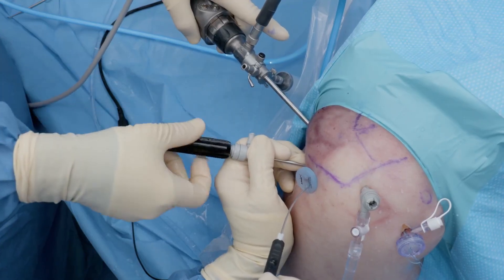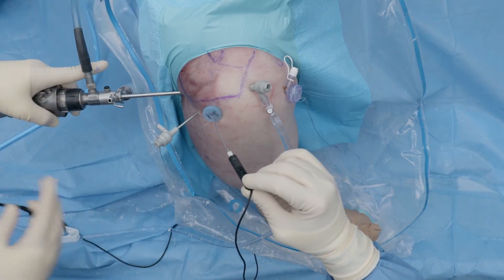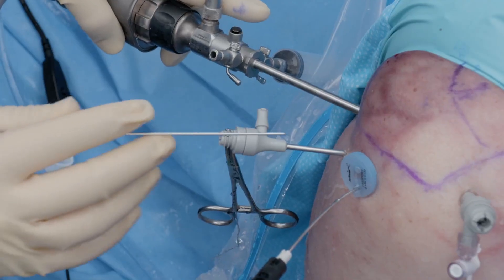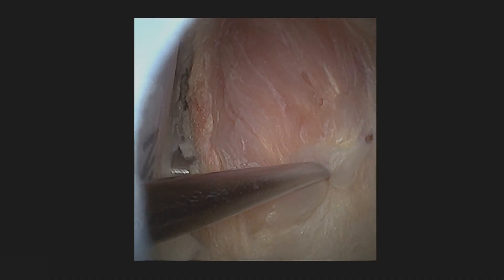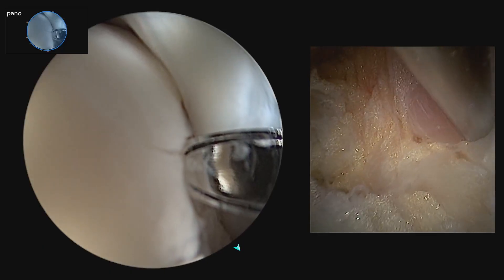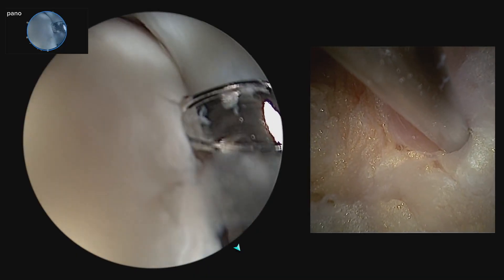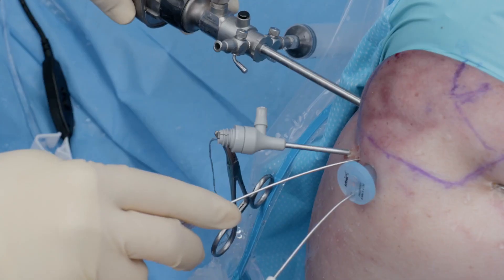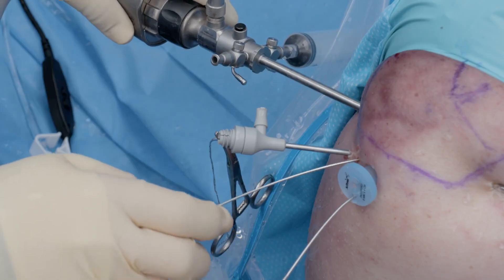We unscrew the black handle, and it's important to leave the high flow sheath in place and taut against the bone in order to protect our sutures during future steps. Going back to the subacromial space using the nanoneedle, we watch as our needle comes in for superior anchor placement. We can see that our superior anchor will be at the musculotendinous junction of the infraspinatus and confirm that both anchors will be of similar trajectory.